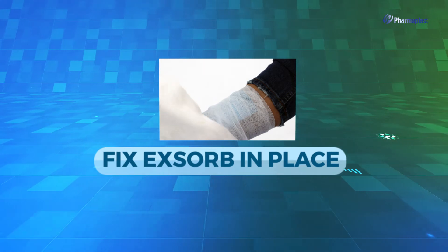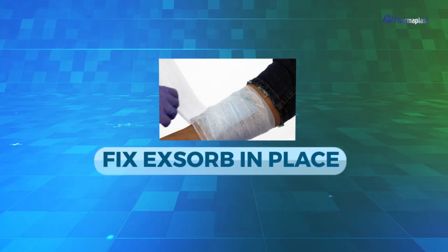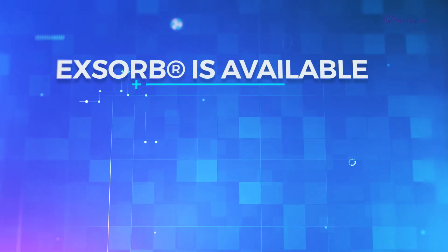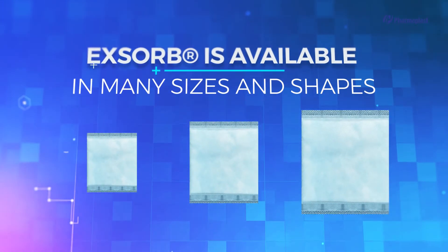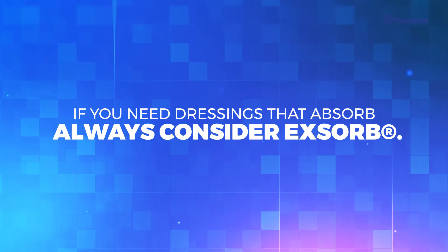Finally, fix Exsorb in place by wrapping the gauze dressing with minimal tension. Exsorb is available in many sizes and shapes to suit every patient's needs. If you need dressings that absorb, always consider Exsorb.